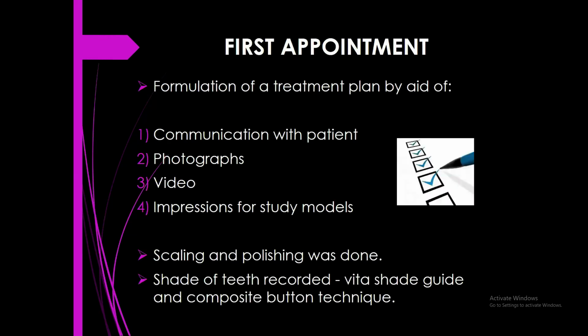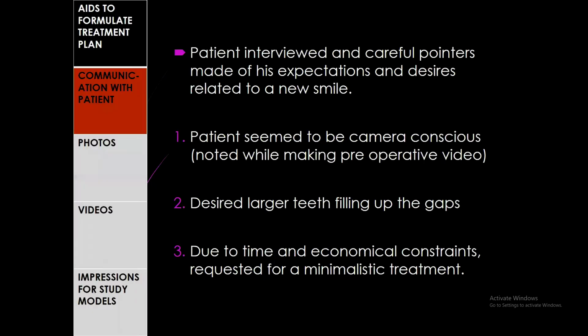So in the first appointment, we collected all the data and information that will aid us in a proper treatment plan. It includes communication with the patient, taking photographs, videos, and impressions for study models. Oral prophylaxis, scaling and polishing was done for the patient. And before we did that, we recorded the shade using the Vita shade guide and the composite button technique.